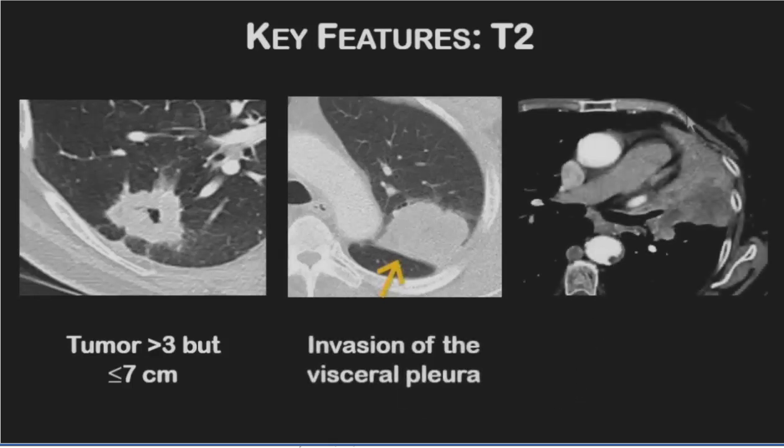And finally, we can see here that this patient has left upper lobe collapse. But we can see that within this left upper lobe collapse, there are regions of hypoenhancement and low density, which was consistent with tumor involvement, and we can see abrupt cutoff of the left upper lobe bronchus.